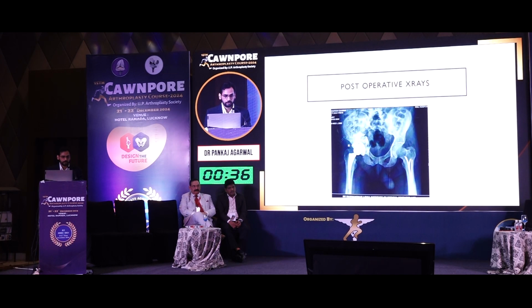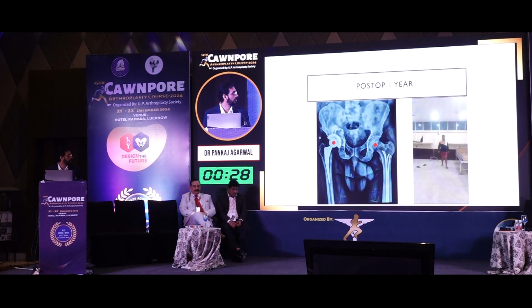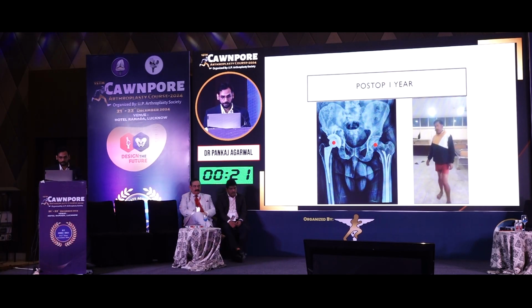So this patient was managed by simple bone grafting and a standard acetabular shell and 2 screws. And this is the immediate post-op X-ray, and this is the X-ray at 1 year. And this is the video of the patient walking without any limp or any pain.